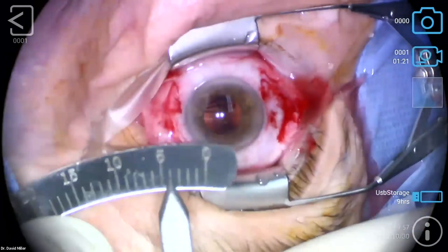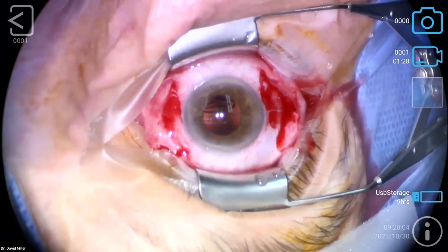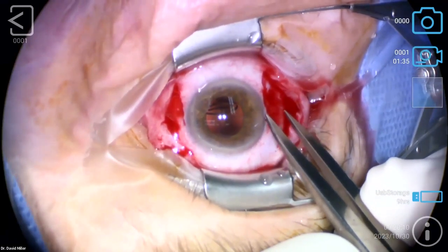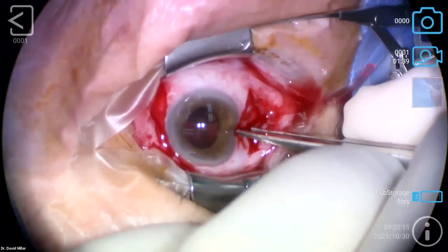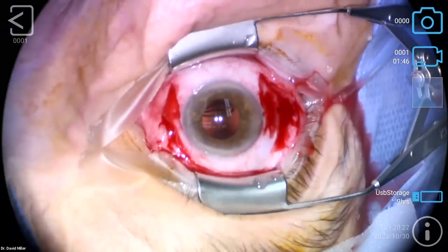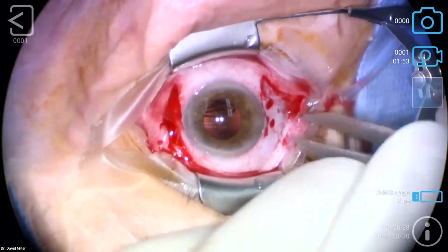So the first question is, how far back do you go? Well, a lot of the articles you see in the journals say 3. And what I found with 3 is, one, it works, and it's supposed to be equivalent of in the bag calculations, which is nice. But the problem with 3 is sometimes the haptics of the lens implant or the sutures are rubbing against the iris. Q-tip there? Yep, sure do. So we measure 4 millimeters back. So I use an extra millimeter, which I found to work really well.